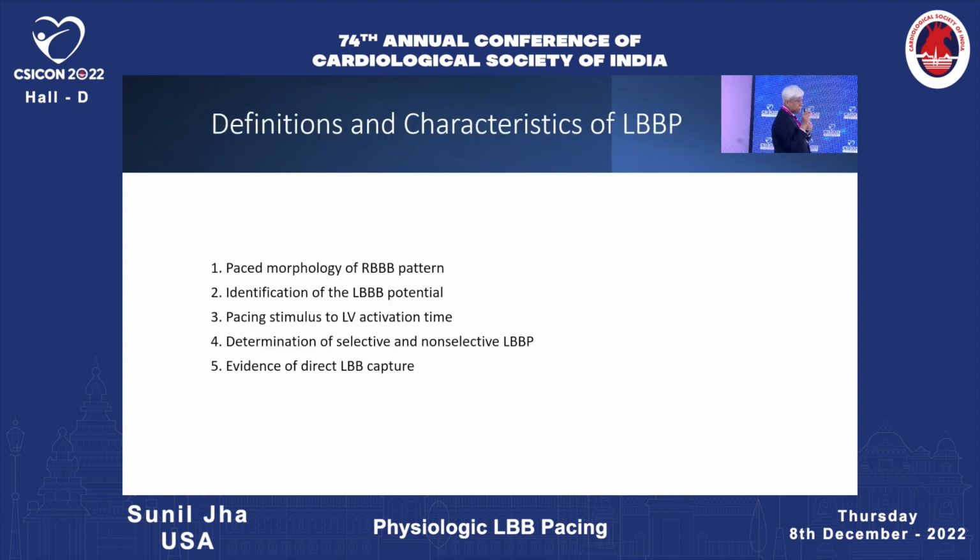So once you are there, you confirm the left bundle pacing. Any one of the criteria will do. You don't have to have all the criteria in every case. You will not find it. You will not get all the criteria.